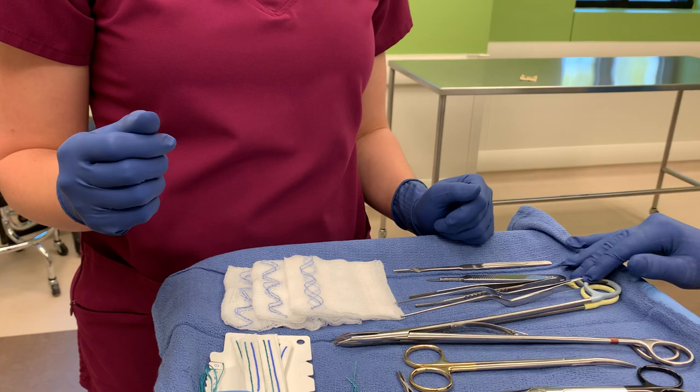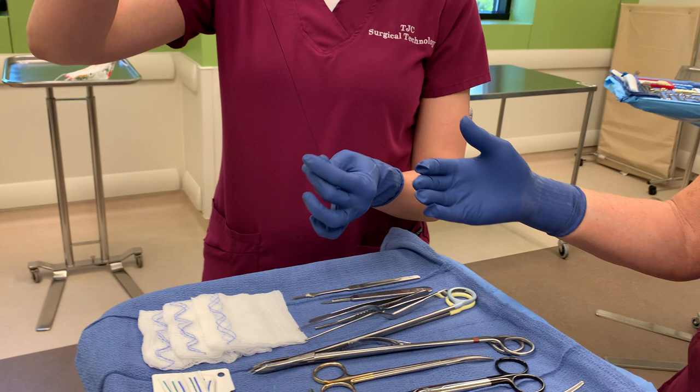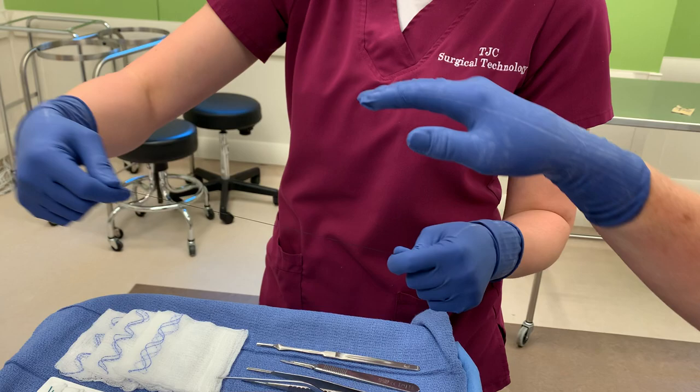Now, free ties. If the surgeon asks for a free tie, they will put their hand out two different ways. I'm taking this off my mayo. They will either do their hand like that — see how I have top and bottom — and I go like that and their hand grasps on it. Or they'll have their hand with their palm facing down and you just go up like that. So it's either sideways or up, and then you just let go and they hold on.